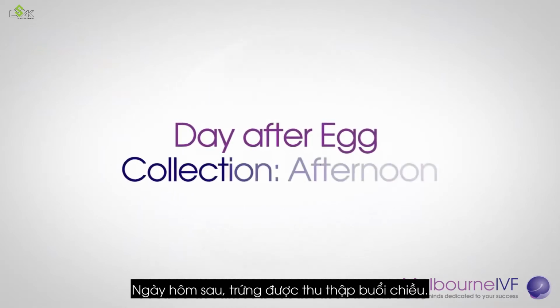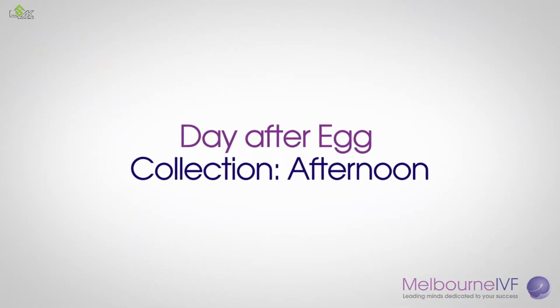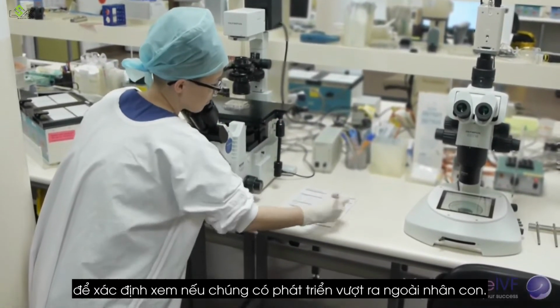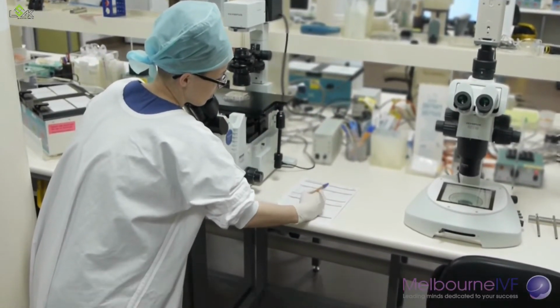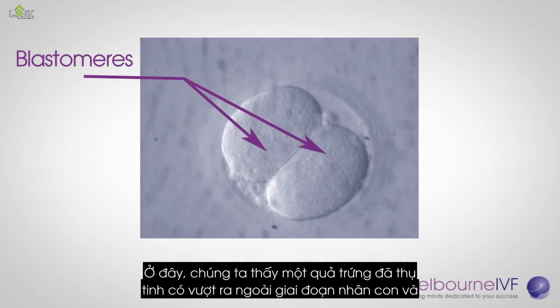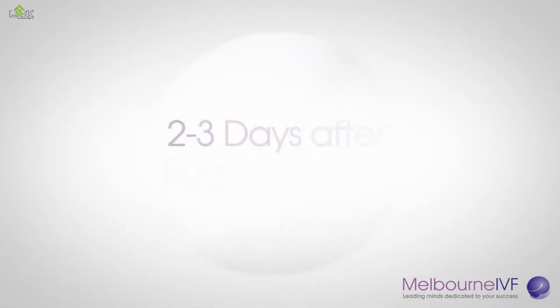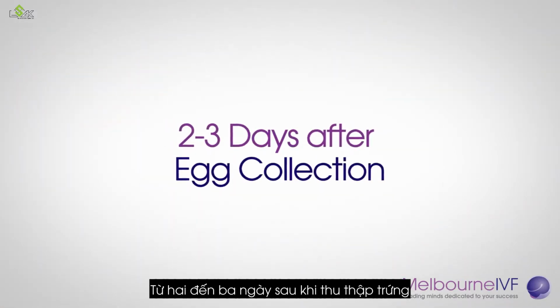The day after egg collection, afternoon. Embryos are then assessed towards the end of the day to determine if they have developed beyond the pronuclear stage. Here we see a fertilized egg which has gone beyond the pronuclear stage and divided, resulting in 2 cells called blastomeres.